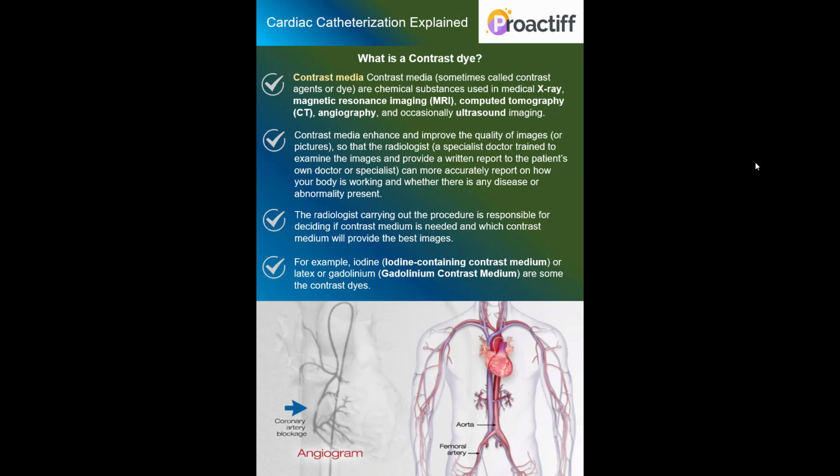The contrast media improves the quality of the images so that the radiologist, the specialist doctor trained to examine the images and provide a written report to the patient's own doctor or specialist, can more accurately report on how the individual's body is working and whether there is any disease or abnormality present.